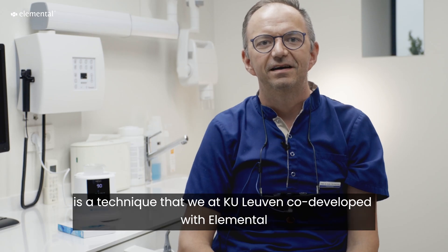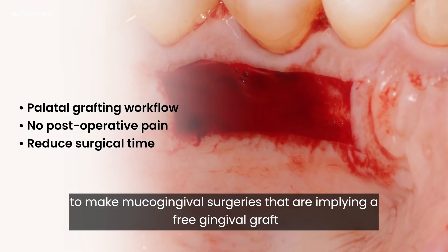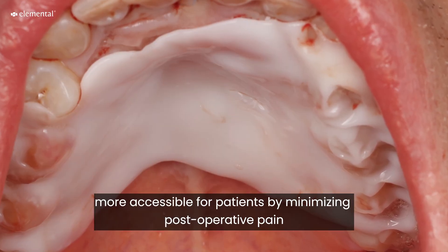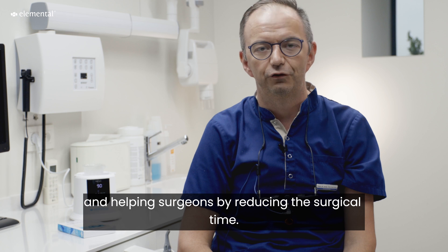The Elemental technique is a technique that we at KU Leuven co-developed with Elemental to make mucogingival surgeries — implying a free gingival graft or a connective tissue graft — more accessible for patients by reducing the post-operative pain and helping surgeons by reducing the surgical time.